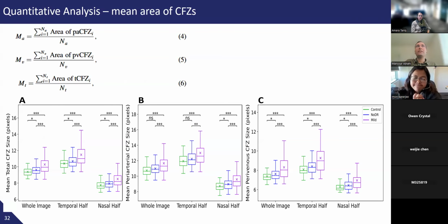And collecting a large data set, especially in healthcare, is complicated because there are many exclusion criteria, many problems, and that cannot give us a large data set. But when we are developing deep learning models that are extracting features, and then we are using them for the classification, it is more useful.